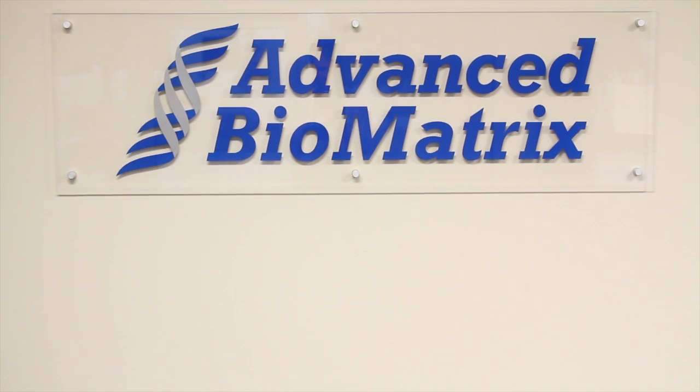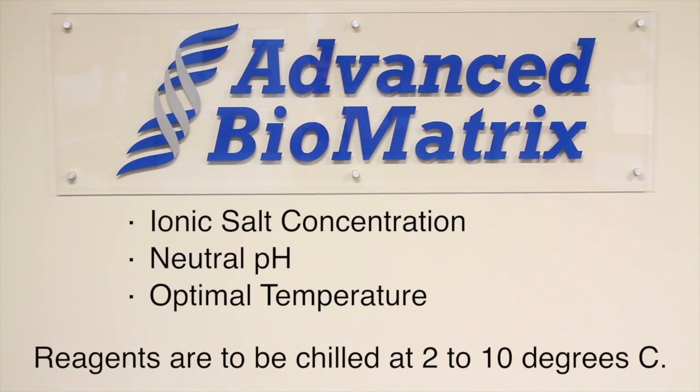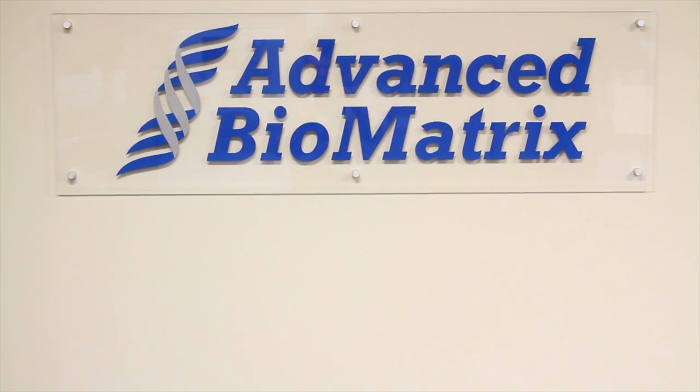Important parameters for preparing 3D collagen gels include ionic salt concentration, neutral pH, and optimal temperature. These parameters will all be specifically discussed as we demonstrate this collagen preparation procedure.